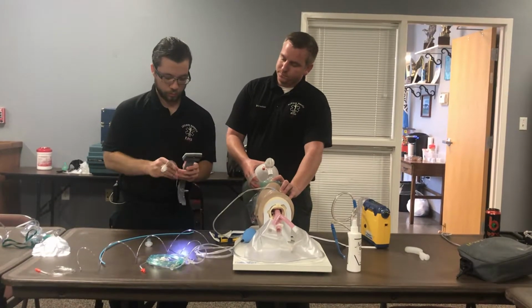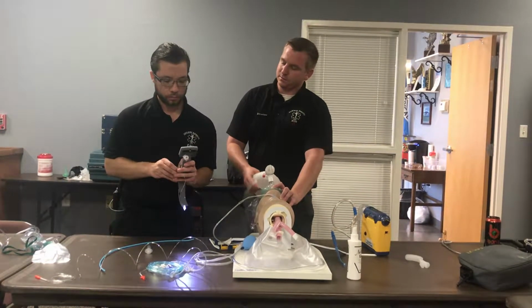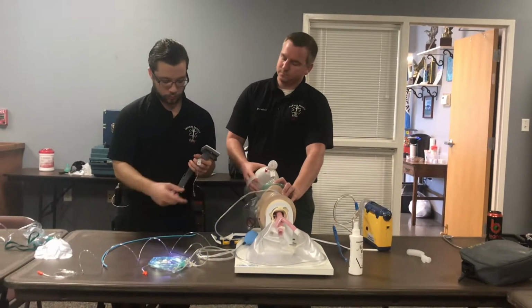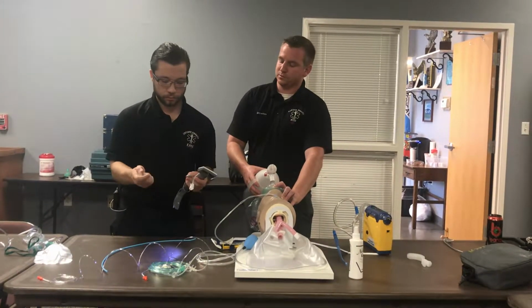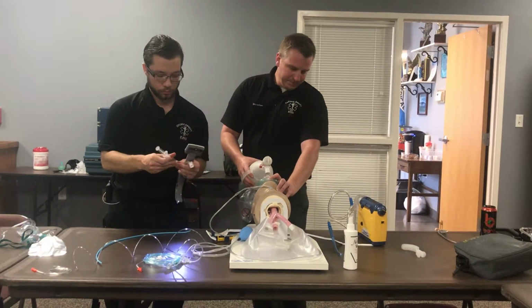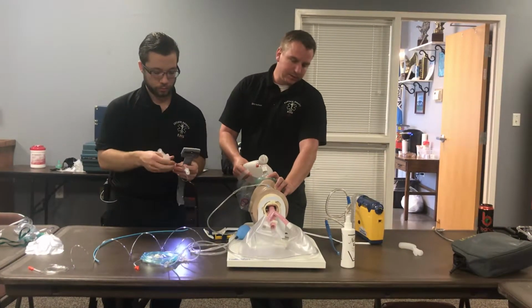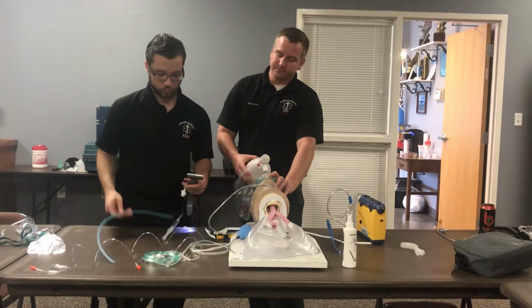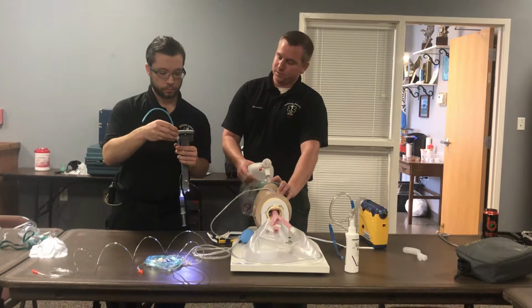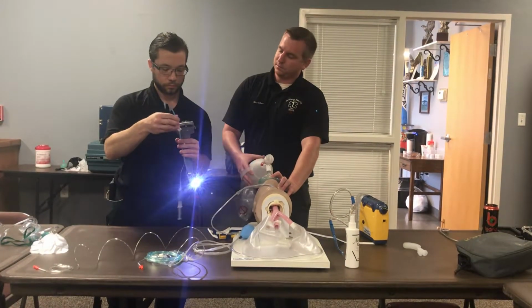He's got his tube, he already checked the cuff on that, there's no holes. And we've already used this a couple times, so the channel for the tube is lubricated. He's already put the securing device behind the patient's head. Levi likes the bougie, so he's going to use the bougie and the King Vision.